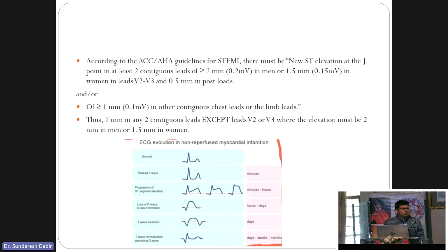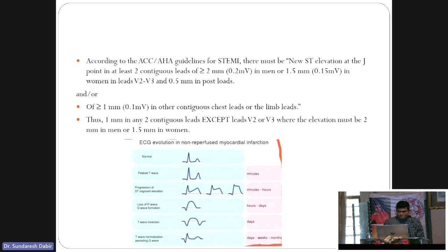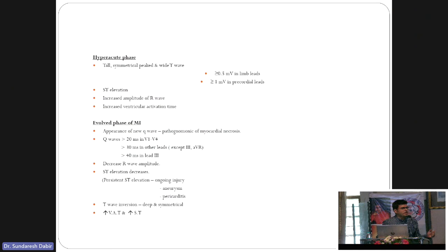The most important thing in ST elevation MI is the evolution through characteristic phases. The first is the hyperacute phase, which comes within minutes to hours. You see hyperacute T-waves — tall, peaked, broad-based T-waves. The cutoff is 5 mm in limb leads and 10 mm in chest leads, or more than 50% of QRS height.